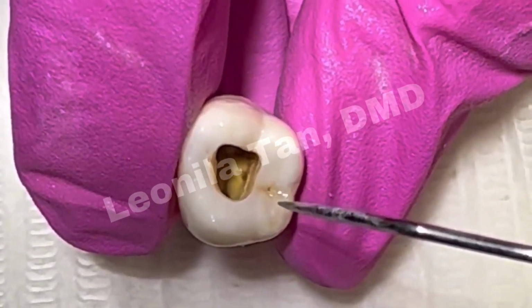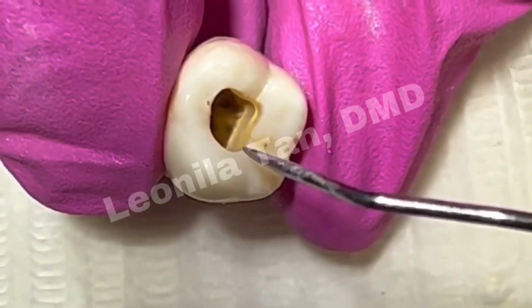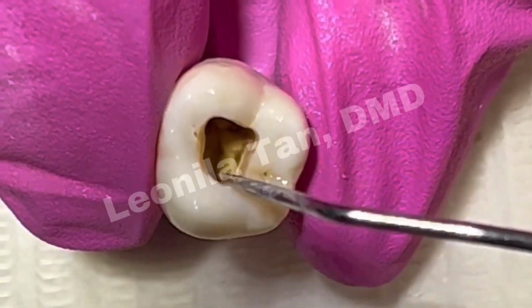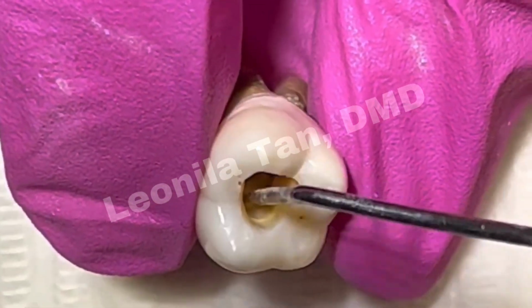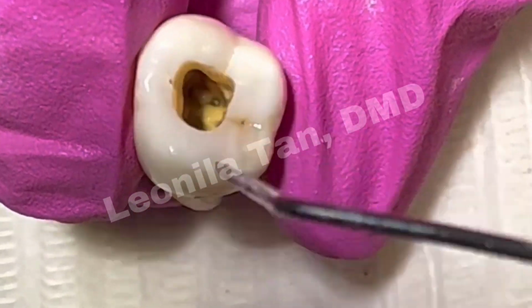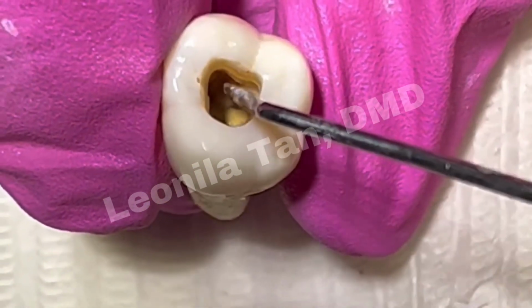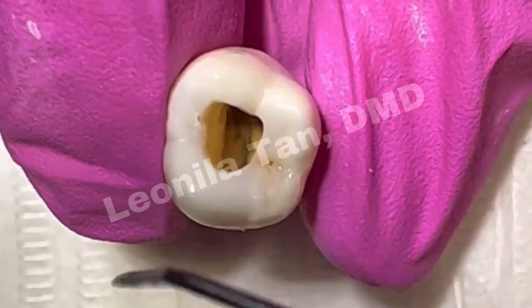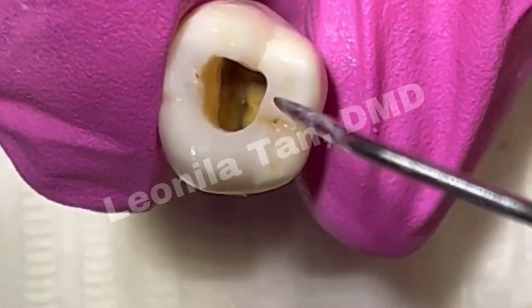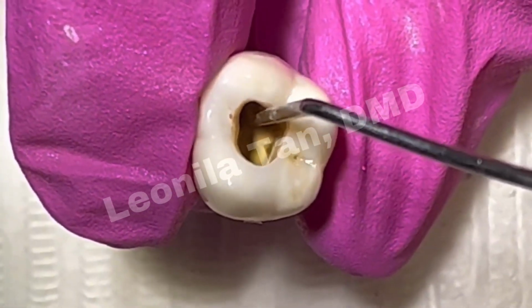So the completed access preparation for the molar is triangular, and you see the orifices, the palatal, and the mesiobuccal, and the distobuccal. And take note, the floor of the chamber is very clear.